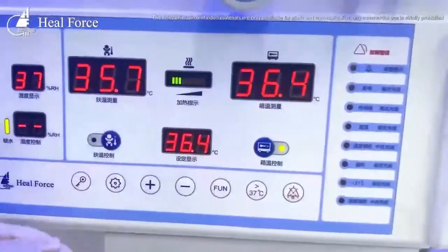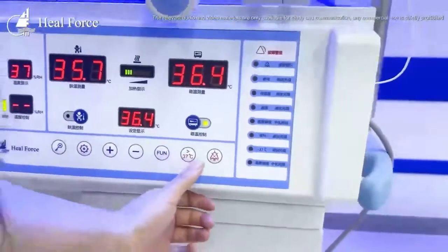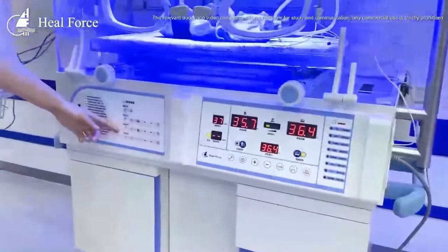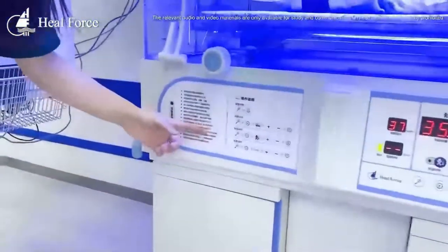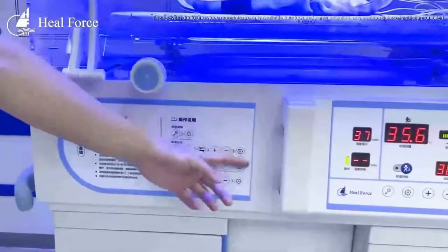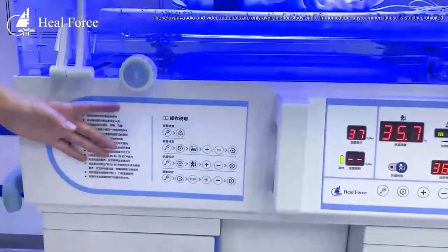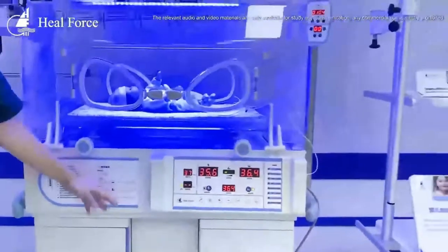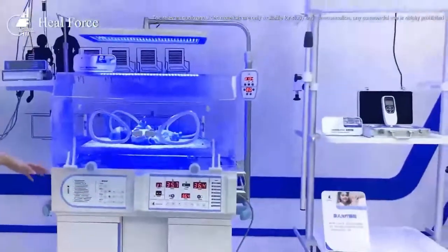There are other settings with button controls and multiple alarms. On this side, you can see there is an easy manual for the operator. We also provide an international version with English or other language options.